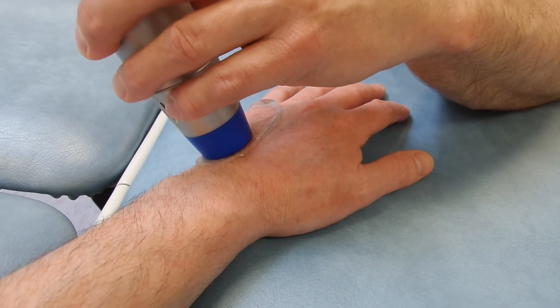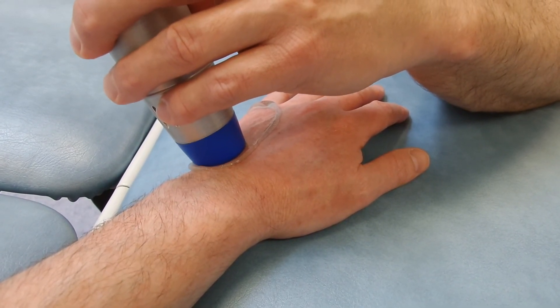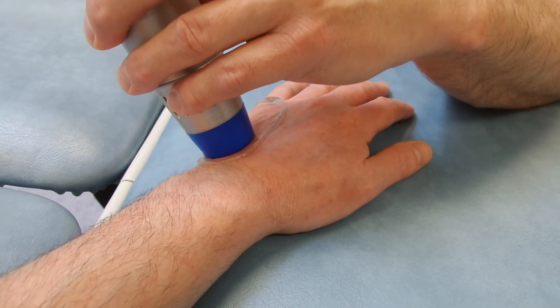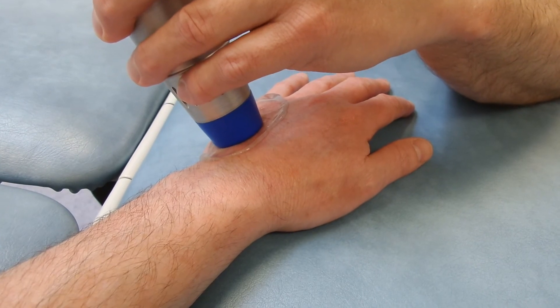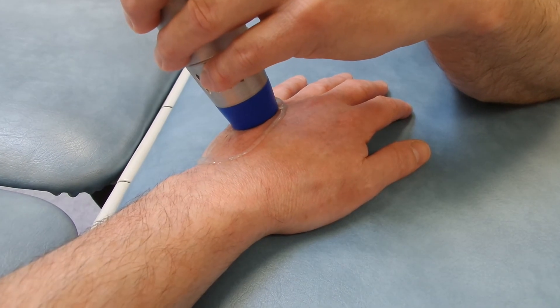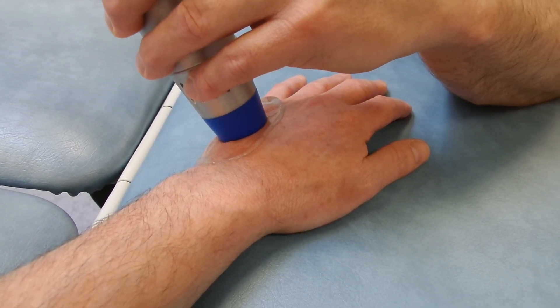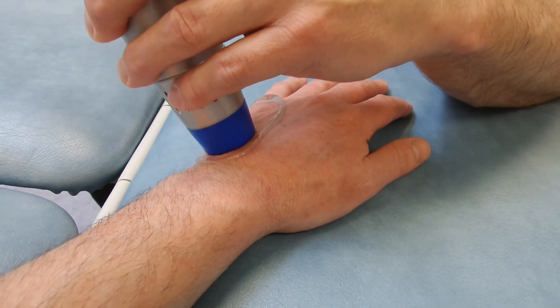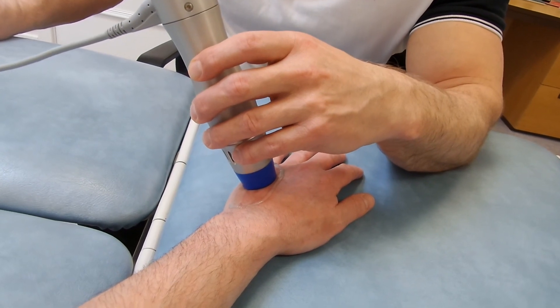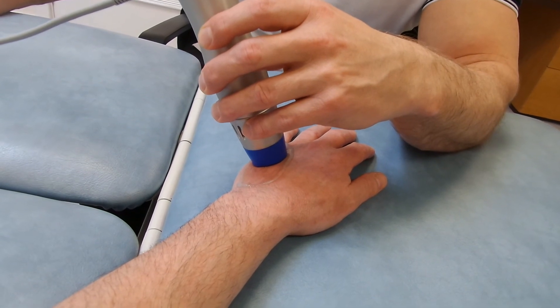I can feel this really bashing it, really into it. There's something about this particular machine — it's very direct. And bearing in mind this is the same power setting as the other one, this is particularly intense. I wonder if it's the weight of the head — because this head weighs nearly 2 kilos. But look at how it's actually jumping around in your hands. The shock that this is producing is massive.